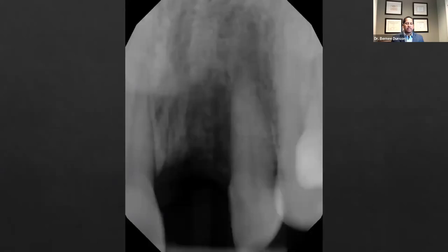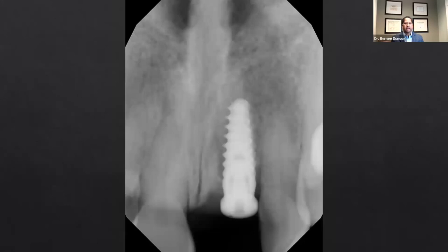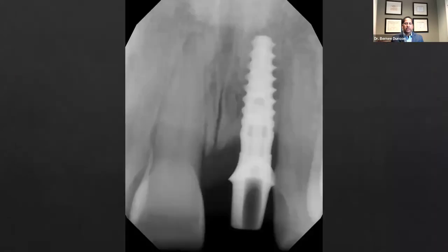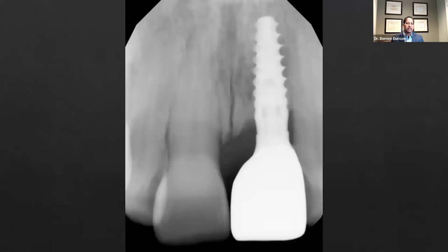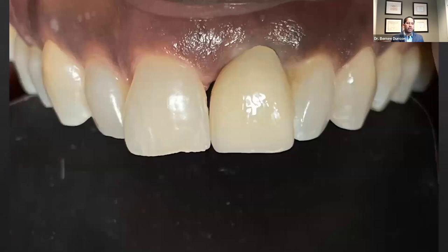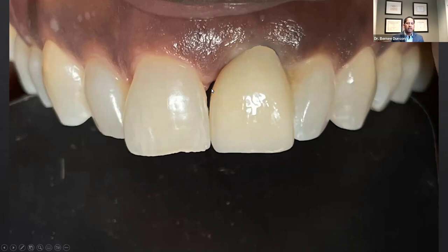Here's another case. The patient lost a tooth and we immediately placed an implant. The bone sets the tone and the tissue is the issue. In my hands, the best time to place an implant in the aesthetic zone is the day I take out the tooth, for best and most optimal aesthetic results — so I do immediate placement. Here's our implant in place with our abutment some months later, our custom abutment, and the final restoration. On the day we delivered the case, I fully anticipate papillary fill, but that may take a couple of months.